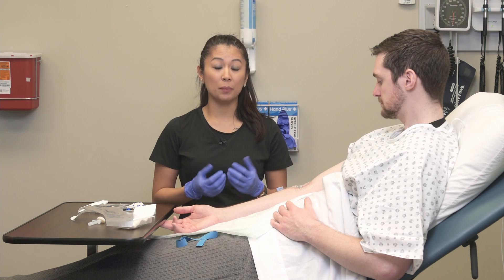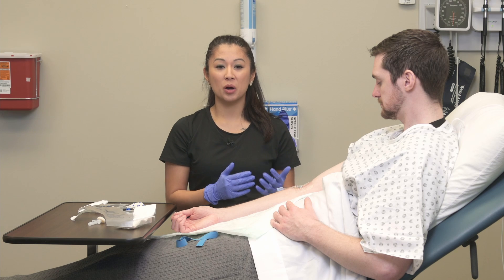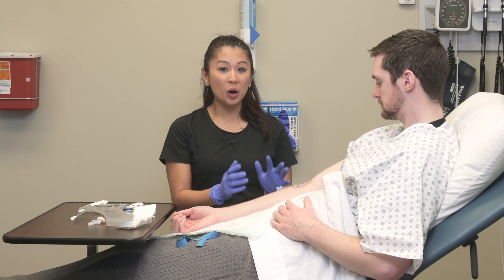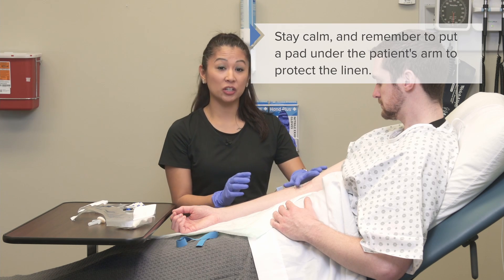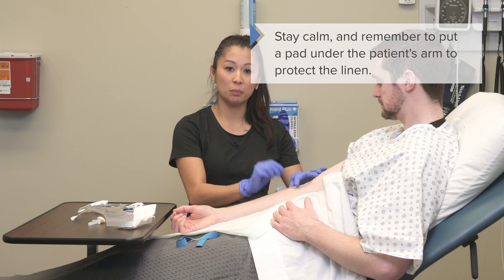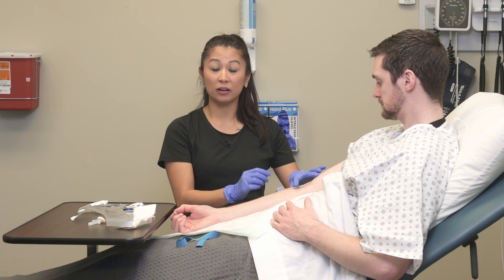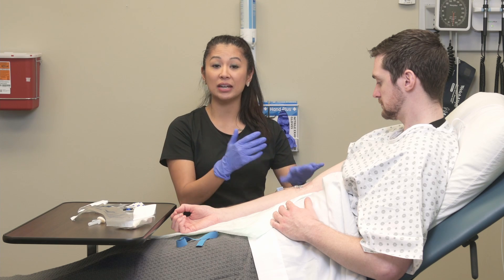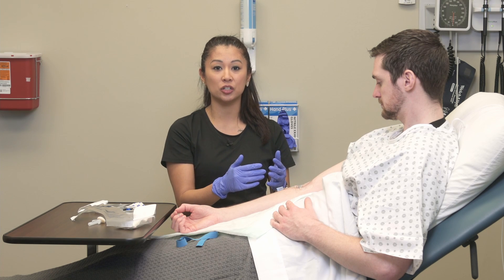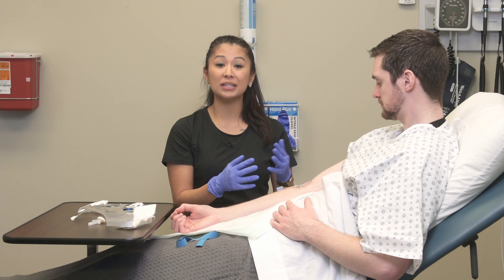Now that we've finished up inserting the IV, I've cleaned up the patient. Notice there can be some blood when you're inserting the IV. When that happened, I kept my cool, made sure to keep the catheter in, and promptly added the extension tubing. You don't want to lose your IV site, so stay calm if that happens, secure your IV, and then clean up your patient for comfort and to make sure there's no blood that can attract microbes and cause infection.